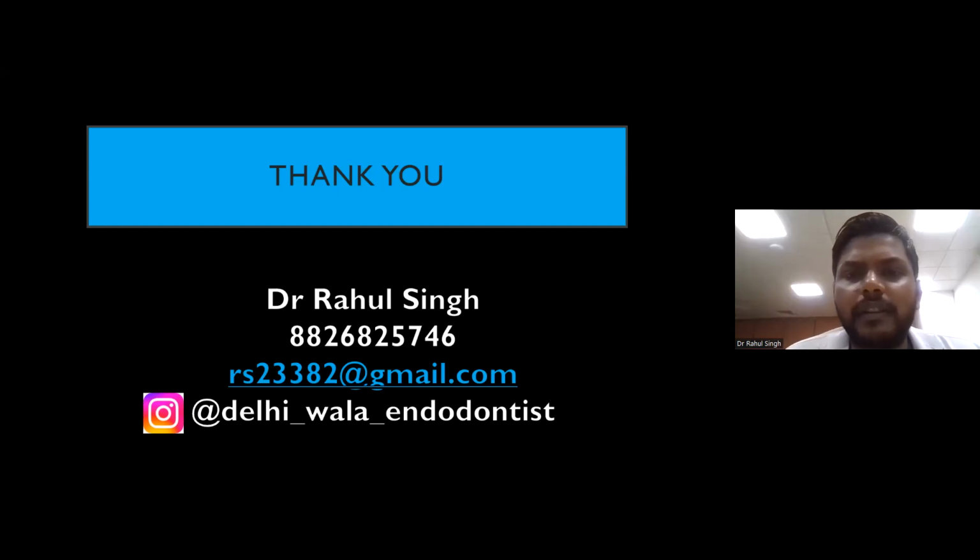Sterilization is really easy. Once you have selected your master apical cone for any canal, single canal or multiple canals, after taking your master apical cone radiograph, once you've seated the patient on the chair, remove the GP from the mouth and have a designated chamber or a designated plate, or I've told, old GP boxes, to keep those GP arranged on, and already fill that box or that plate with 5% sodium hypochlorite.